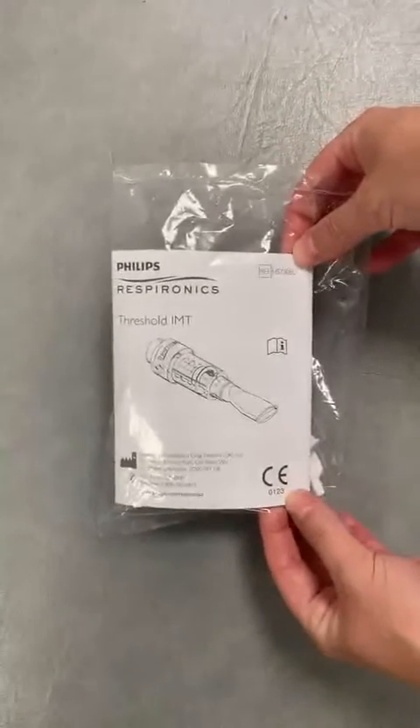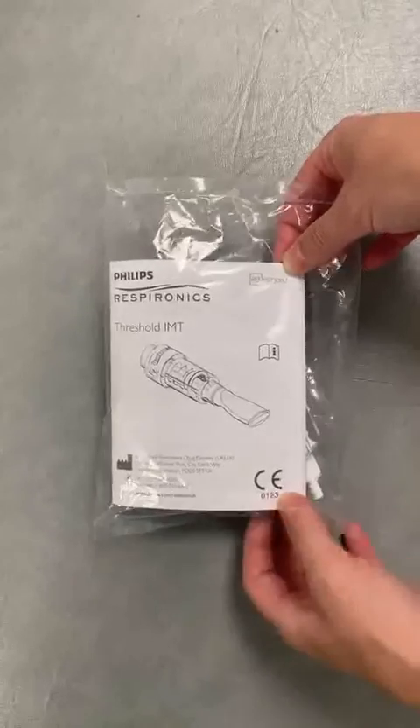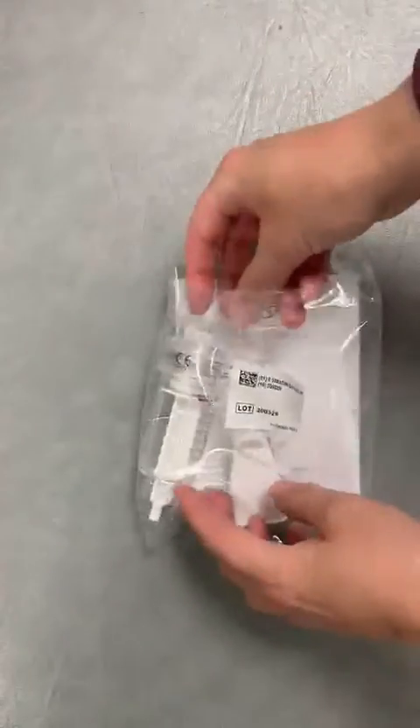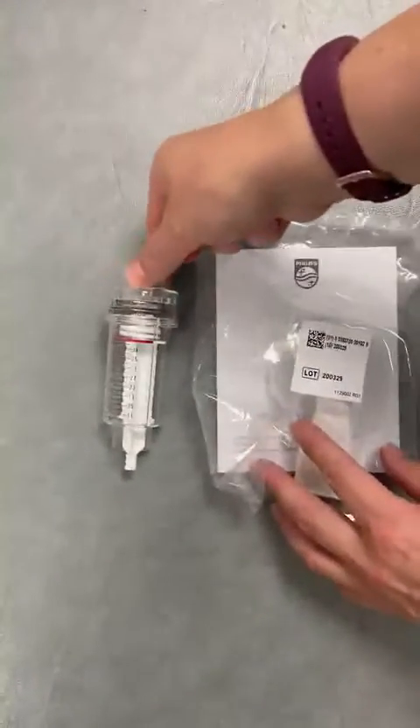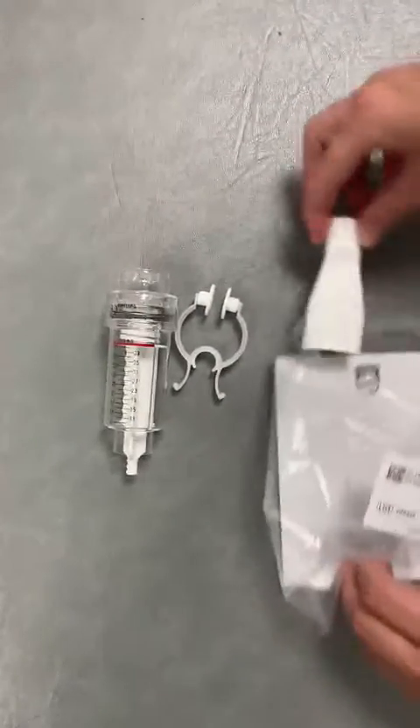This is the Philips Respironics Threshold Inspiratory Muscle Trainer. It comes in a packet like this, and inside you have the threshold device itself, the nose clip, and the mouthpiece.